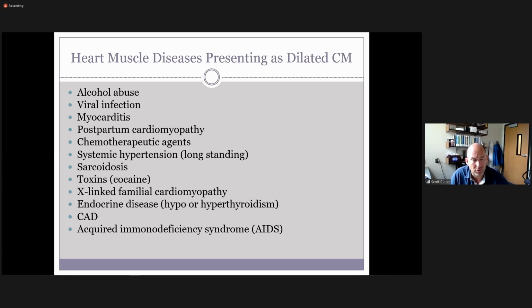But as they give them chemotherapy, you're going to notice that the hearts are starting to get dilated cardiomyopathy. We had a student one year that as a child actually had chemotherapy because of the childhood cancer that they had. And that person's heart was actually fairly dilated. It was kind of round and balloon shaped. It wasn't that nice bullet shaped LV that we normally see. But again, no surprise to what we saw, because that goes along with the diagnosis.